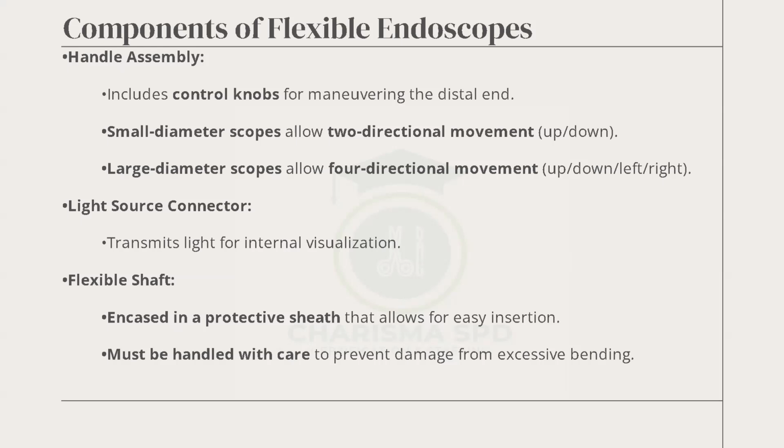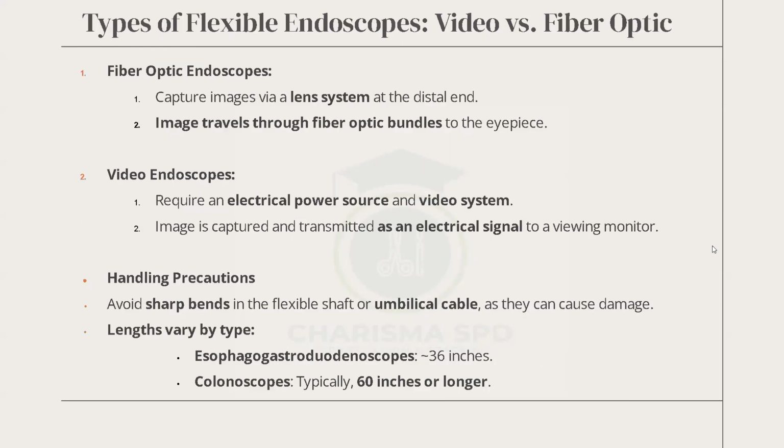You cannot guarantee it is clear unless you plug it in and point it at something, before you can say the monitor looks blurry, therefore the scope is not good. If you overbend it, you break the fiber optics or the lenses. If you put heavy stuff on it, you break it too. They are treated like eggs because they are very expensive. All right, next slide.